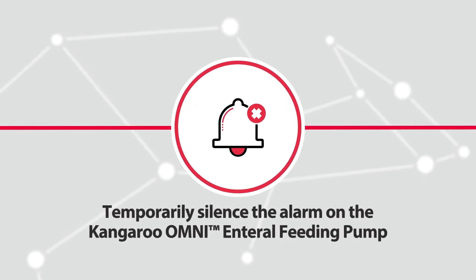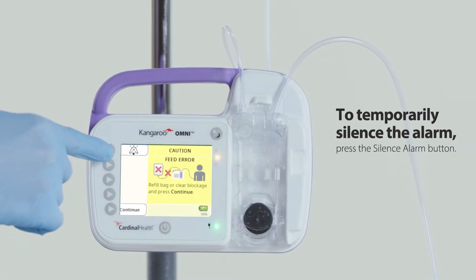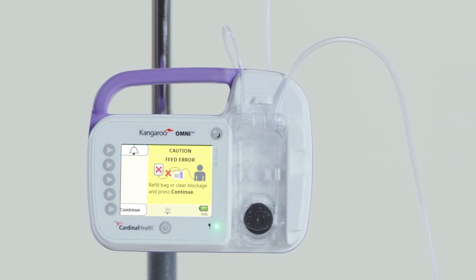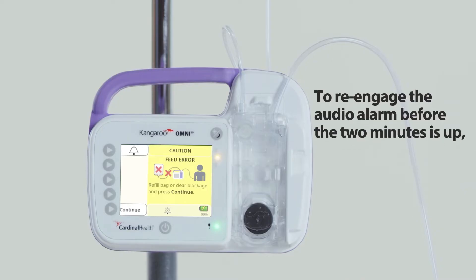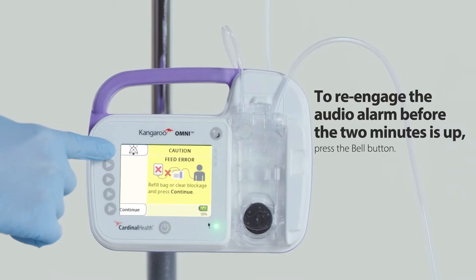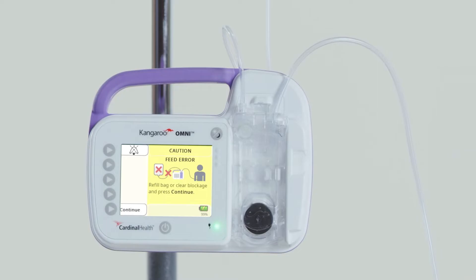Some pump notifications will trigger an audible alarm. To temporarily silence the alarm, press the silence alarm button. This will silence the alarm for two minutes. After two minutes, the alarm audio will restart. To re-engage the audio alarm before the two minutes is up, press the bell button. This will end the temporary audio pause and restart the audible alarm.